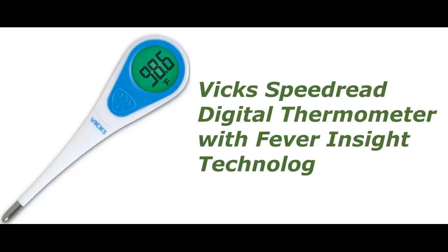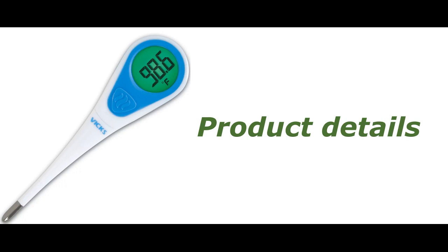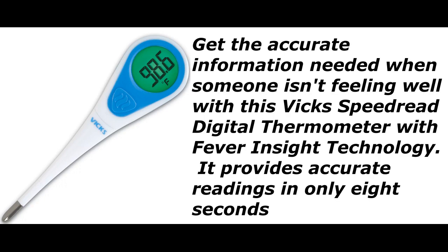Vicks Speedread Digital Thermometer with Fever Insight Technology. Get the accurate information needed when someone isn't feeling well with this Vicks Speedread Digital Thermometer with Fever Insight Technology. It provides accurate readings in only 8 seconds.